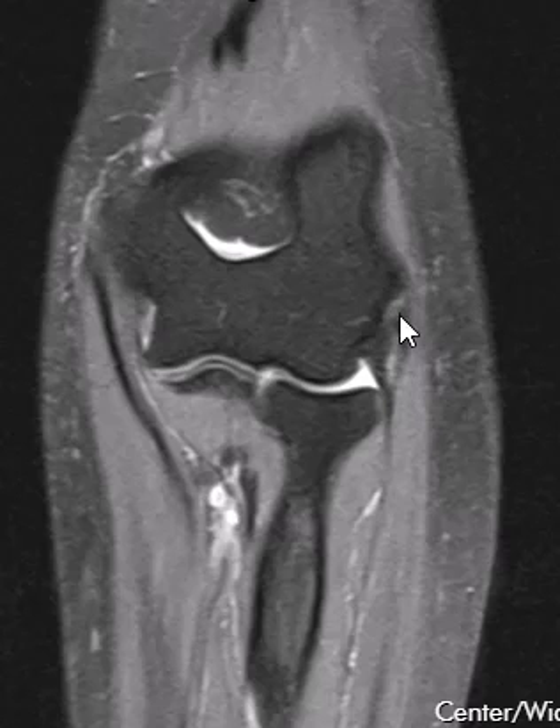So the tendon is irritated, a little bit puffy, and has a little bit of fluid signal — reactive fluid in it. And again, this is what we call lateral epicondylitis.